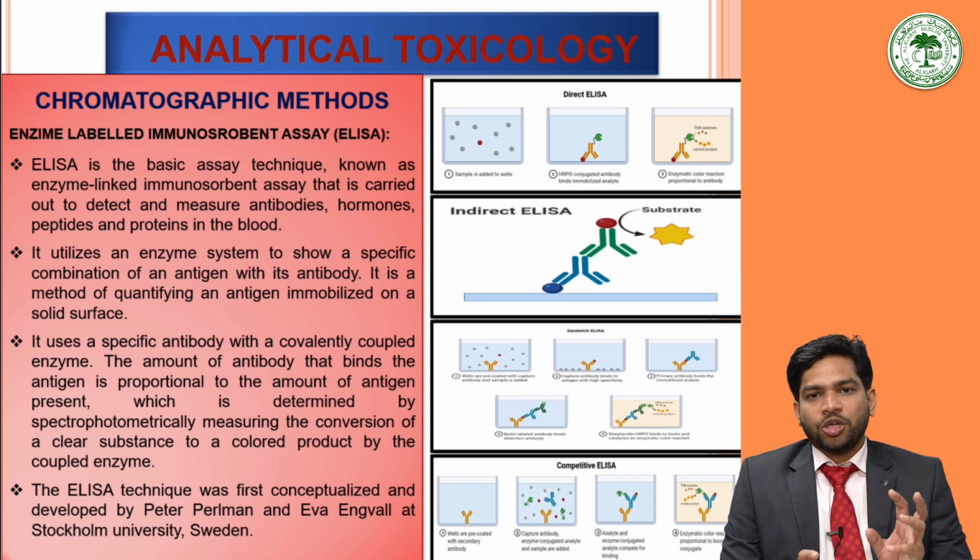In that tube, the solution of the drug is added, that is, the sample suspected to contain the drug X, and the antibody against it is bound to it.